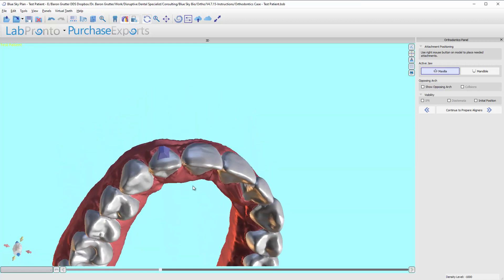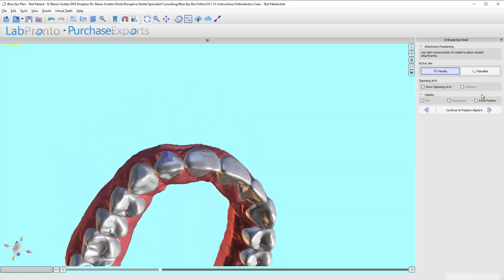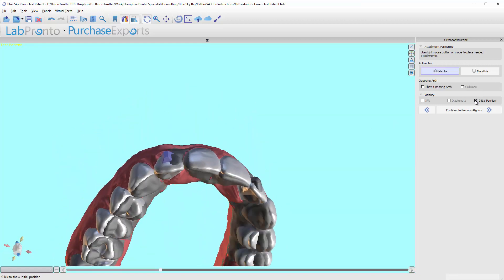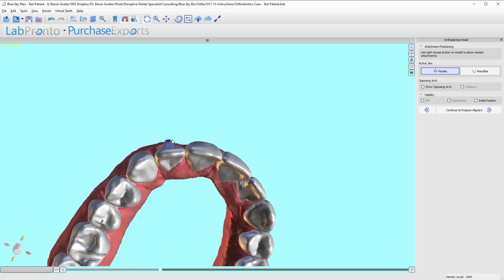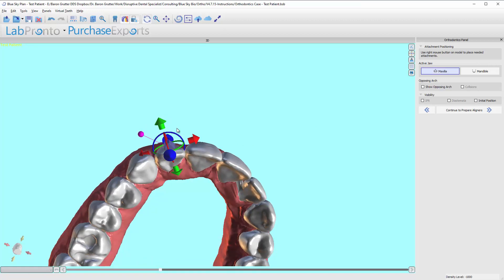Okay, so one thing I will share is that when I have time to, is that I'm trying to rotate this tooth clockwise. So I will rotate the button a little bit counterclockwise.